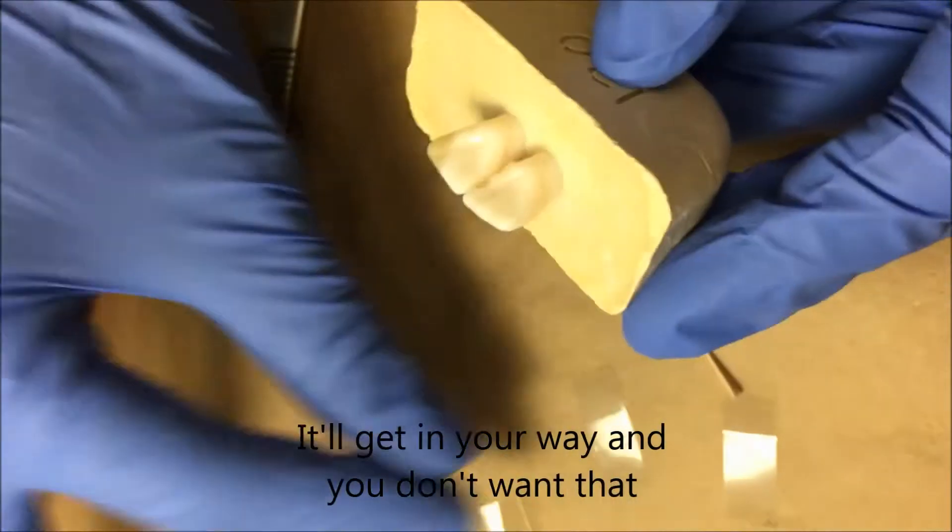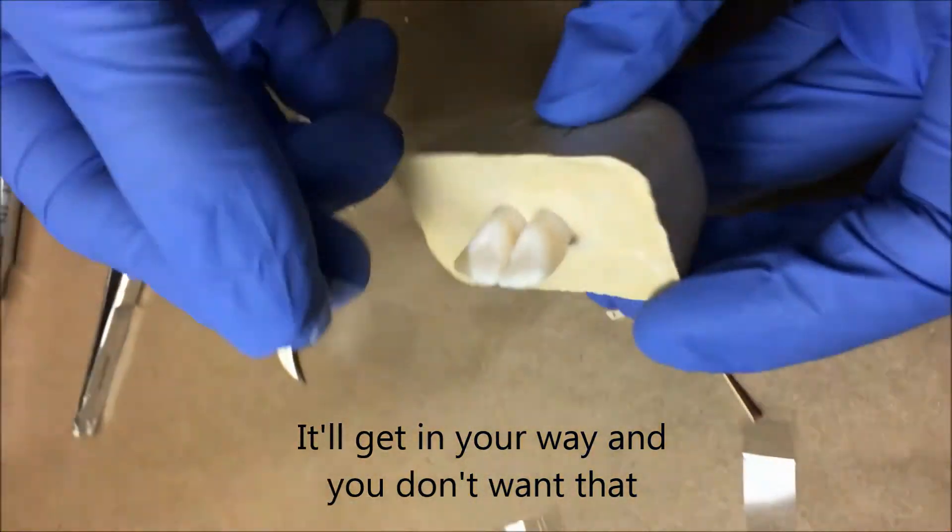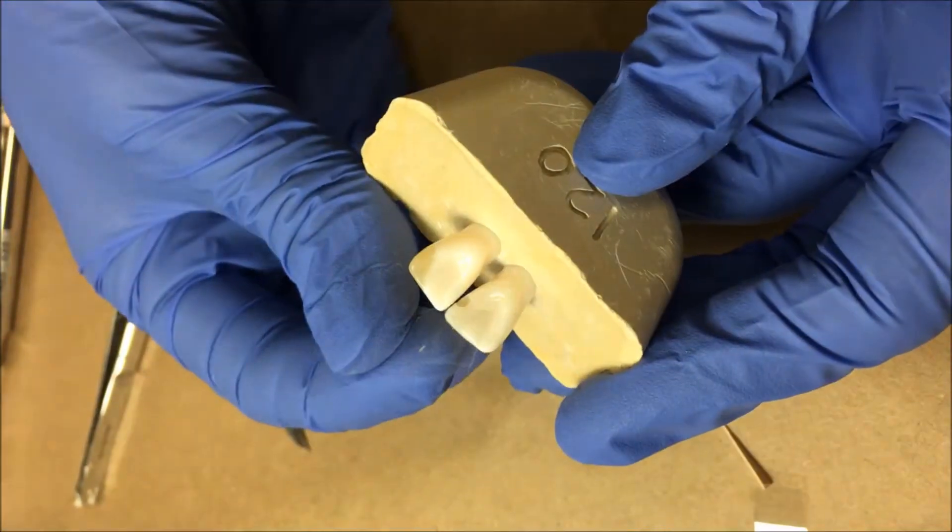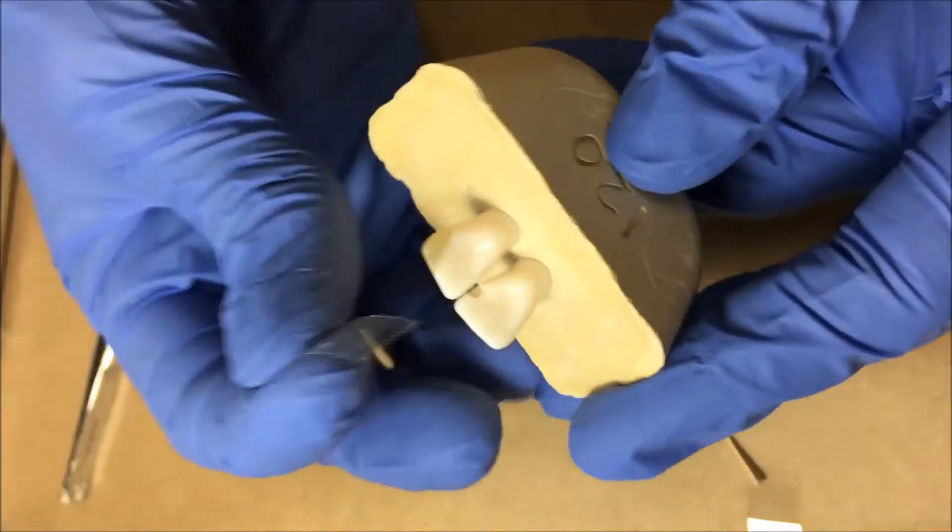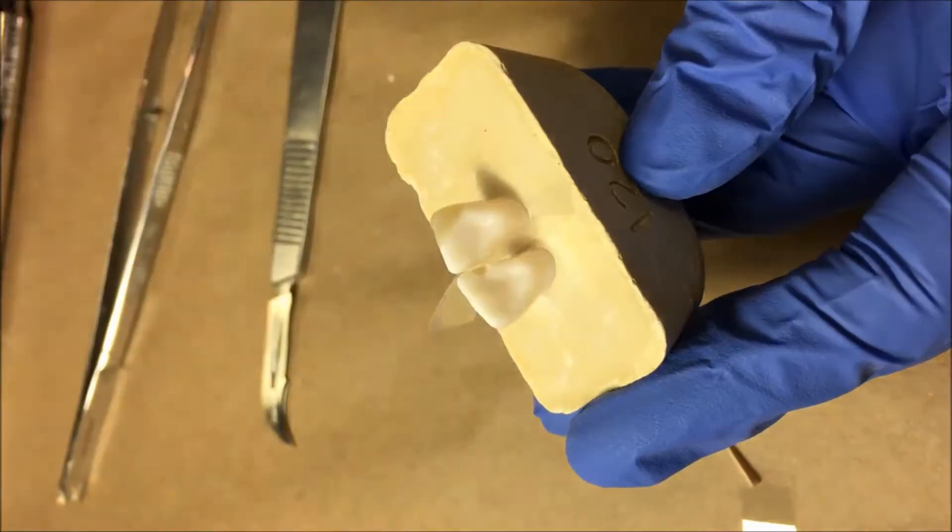So a little shorter, 20 to 25 millimeters is what we had said in lecture. There's kind of a natural curve to these so you may as well just take advantage of that.